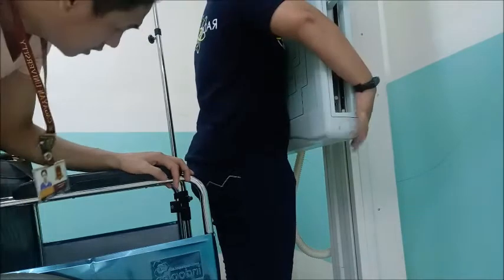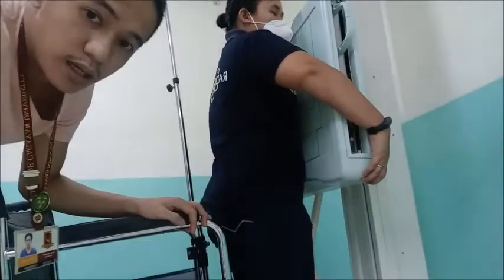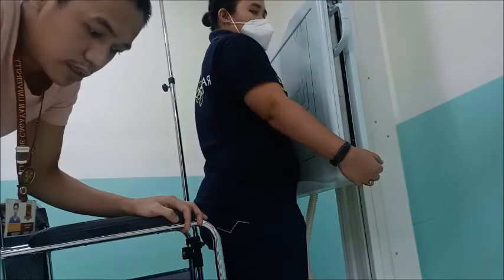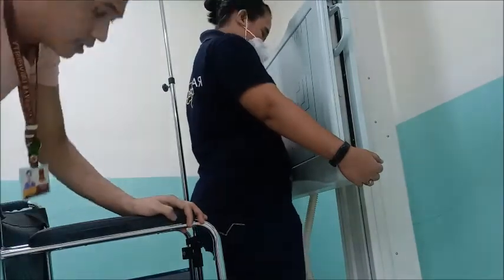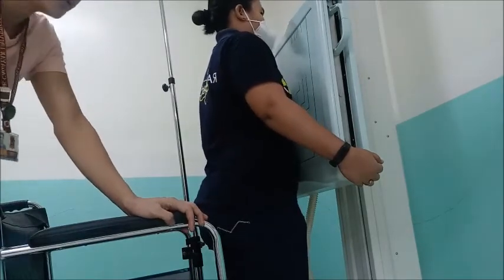So the purpose nga nung na-address si wheelchair is if ever malipong si patient, especially mga elderly, no, some of them would want to stand up during the examination, especially those na ay pleural effusion, na ay tubig ilahang lungs. So, much better get nga naka-upright sila. Okay?